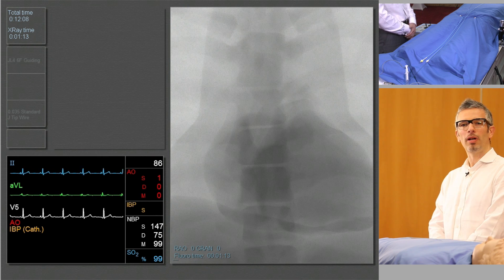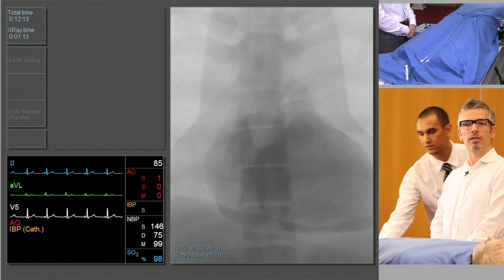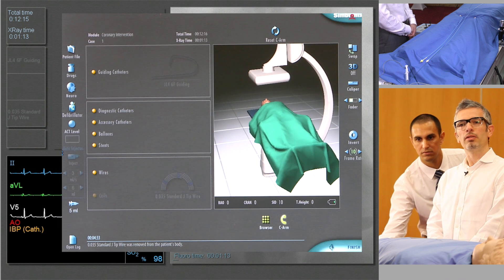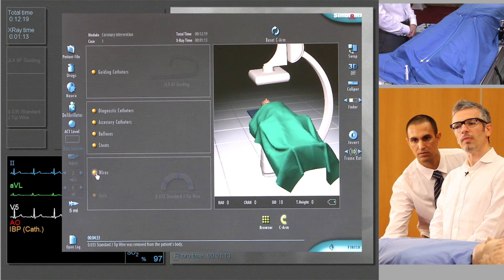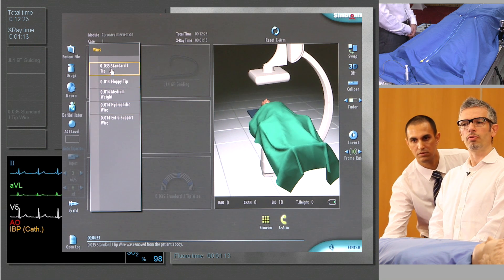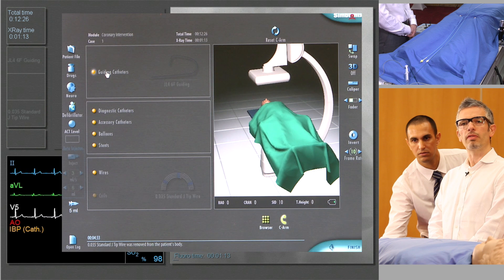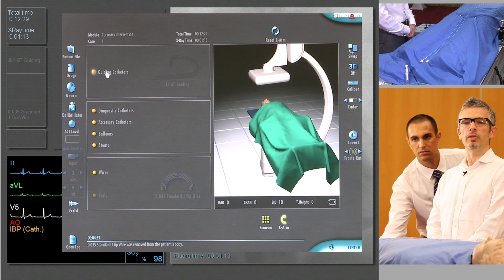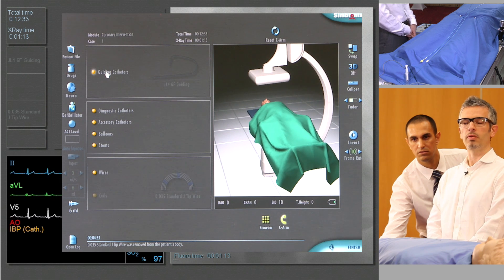We've secured femoral access and we're going to choose a guide wire and a guide catheter that we can navigate through the arterial tree to the ascending aorta. We're going to select an 0.035 J-tipped guide wire. The curve on the end of that wire is going to help our wire not go into any branches, and allow us to steer away from any branches should we encounter that difficulty.